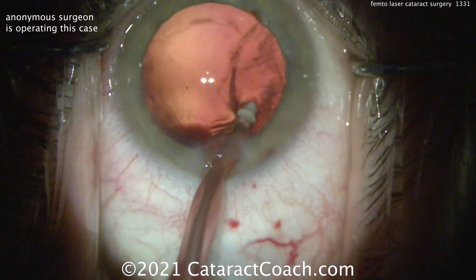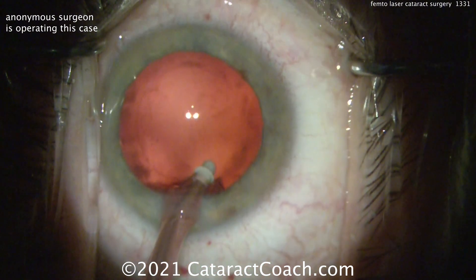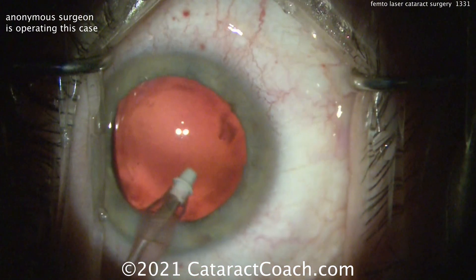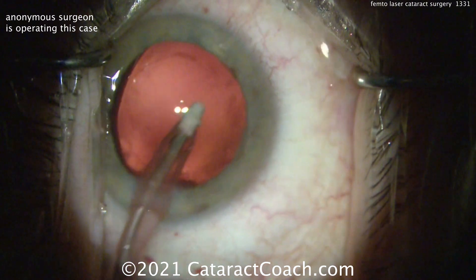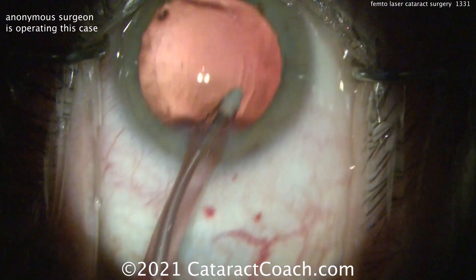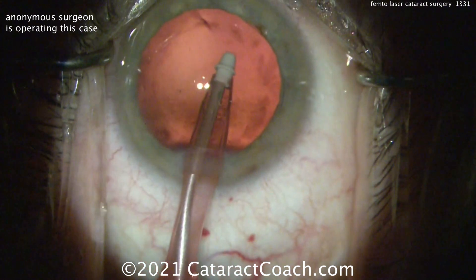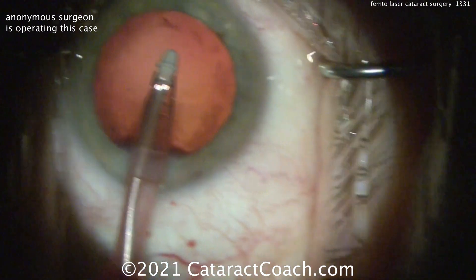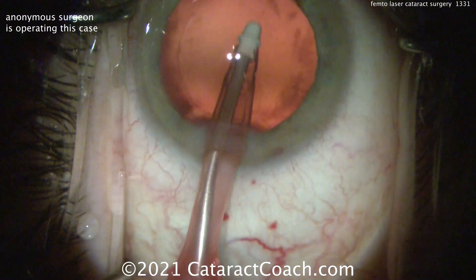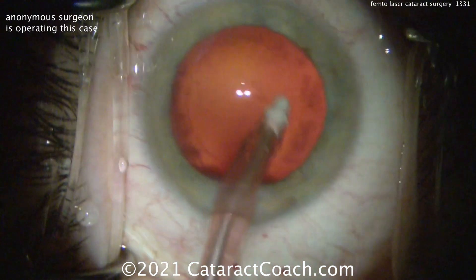So here's cortex removal, looking pretty efficient. Getting all that out, that looks really good. And now time to put the lens in. Using a femtosecond laser can certainly help in the surgery, especially if you're at the earlier stages of your career and you don't have as much skill set just yet. So it can make a surgeon who is struggling to do a great capsulorhexis get a little bit better results.